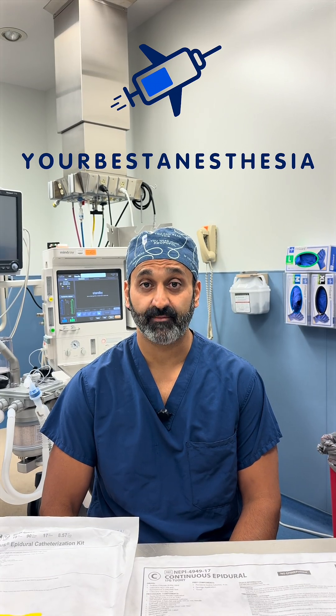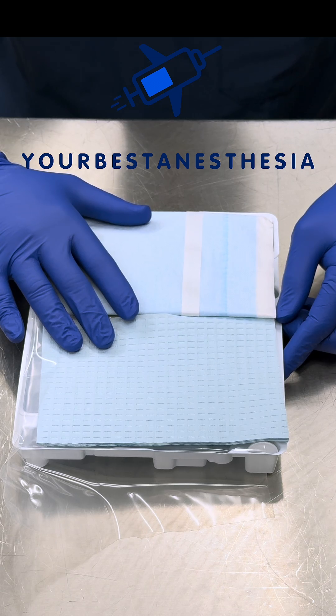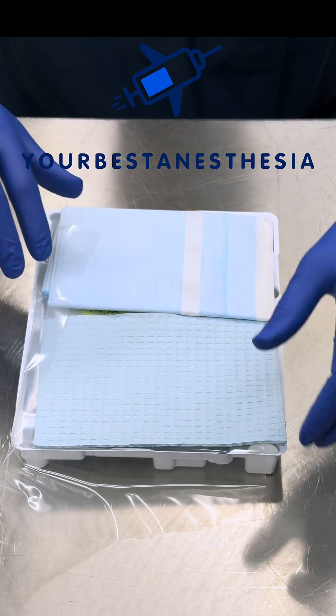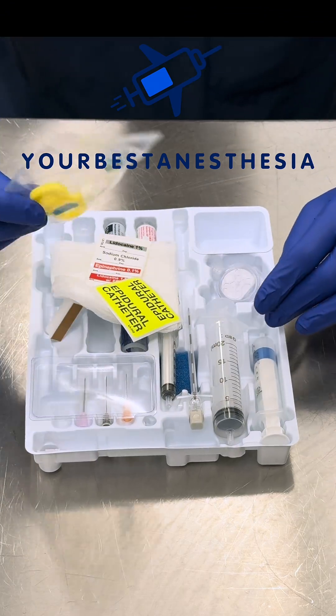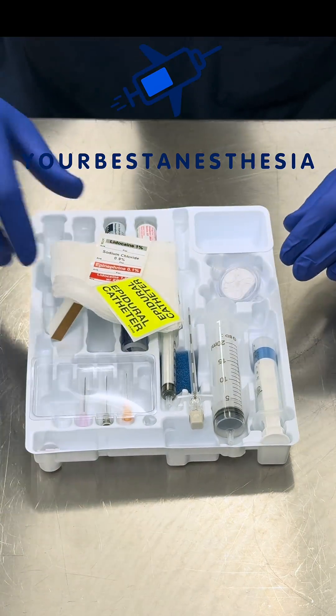What would you put in your dream epidural kit? I've got the kit from PORTEX here. This is the kit that I like to use. It has almost everything that I prefer, but not quite everything. It comes with a paper drape that I really don't like. I no longer use a nylon catheter anymore, but it's still handy to have this connector.